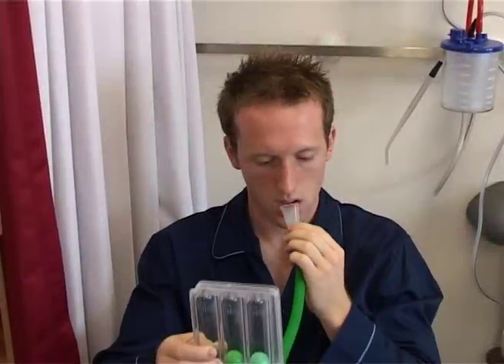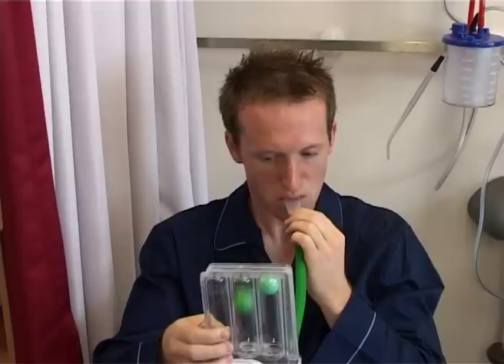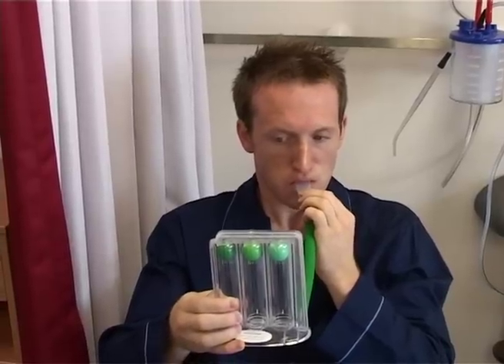Hold the spirometer upright and seal your lips tightly around the mouthpiece. Inhale slowly and deeply to raise the balls in the spirometer.